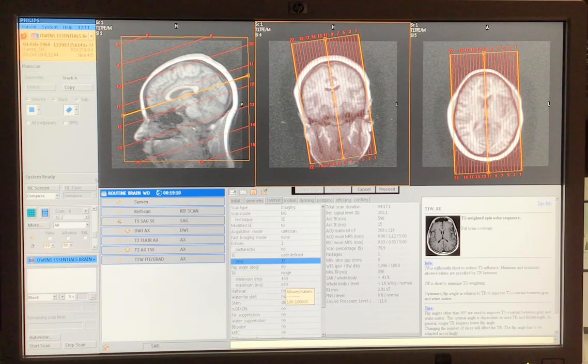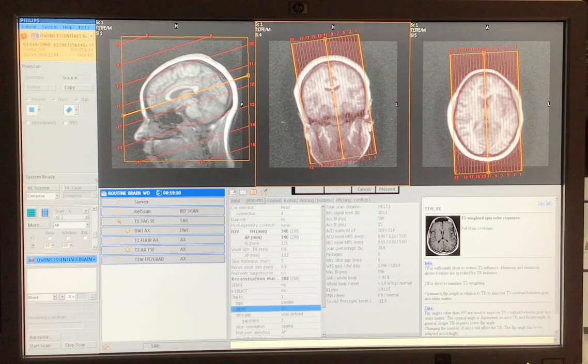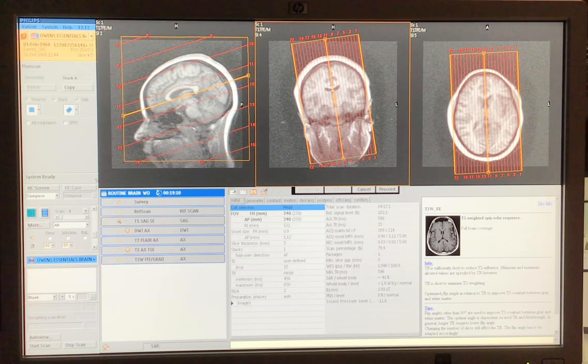So once I get my TR in the range that I want, a low TR and a low TE, and this looks good and I have it set up the way I like it, if I look at C, all I'm saying is, tell me what phase direction you have. I can either go to my geometry page and it'll tell me my fold over, or I can go to my initial page and it'll tell me my fold over, and I can say I want to go A to P. If by chance this was created foot to head, and I change it to foot to head, anything down here is going to wrap up here.